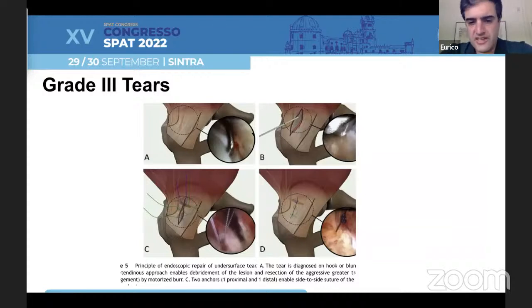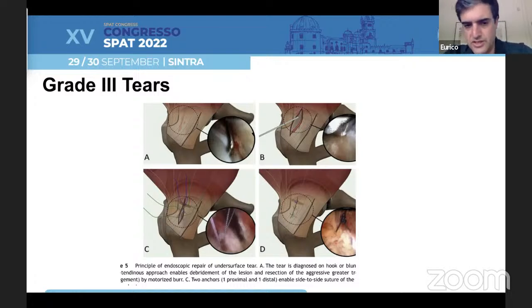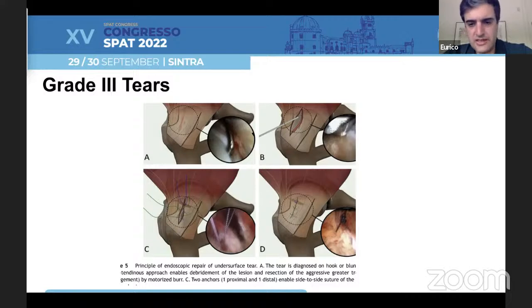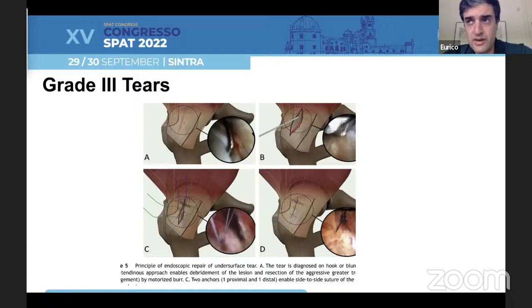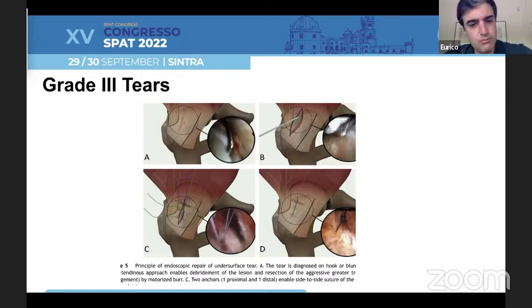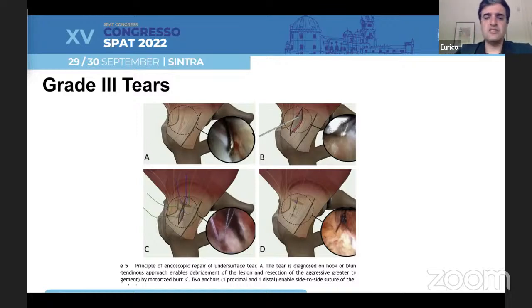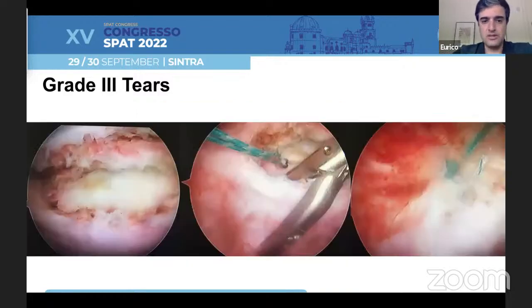In grade three tears, this paper from the Lyon group presents a very good and easy technique. We just complete the tear, go underneath the tendon, place our suture anchors, and close the tendons side by side. We have a side-by-side repair which is mechanically stronger, doesn't disrupt much of the tendon, and we get very good contact between the tendon and the bone to allow healing.